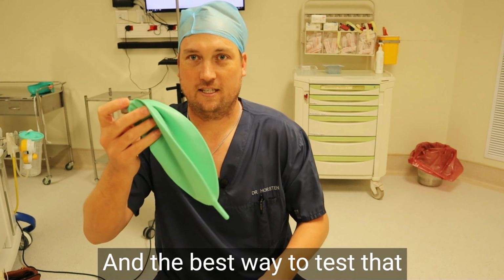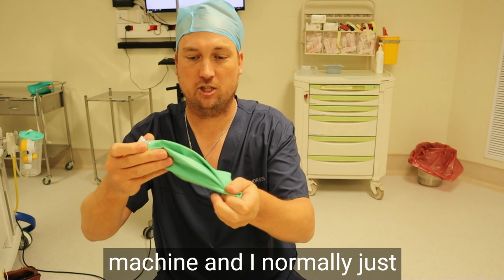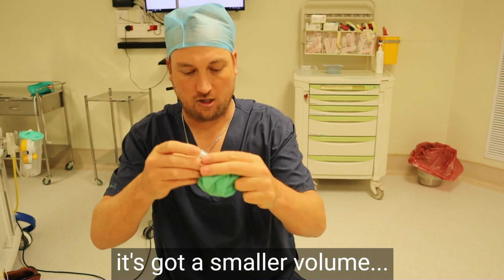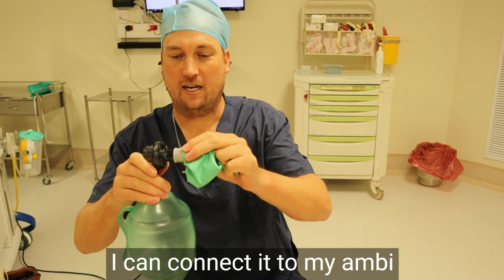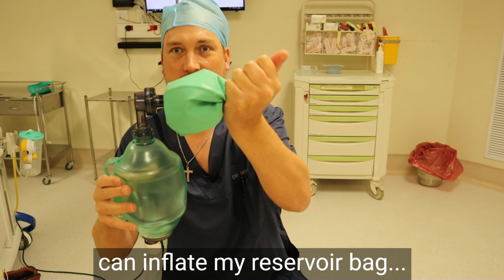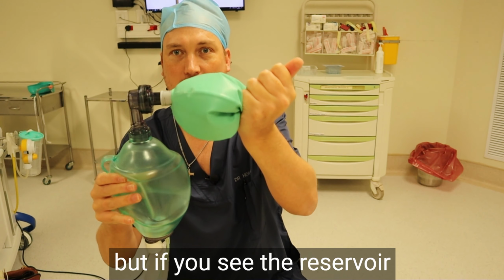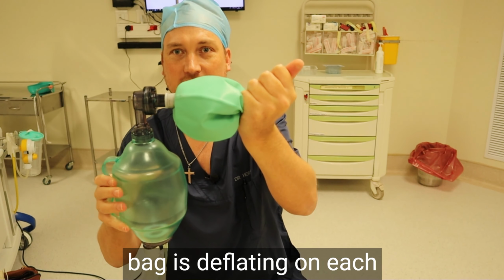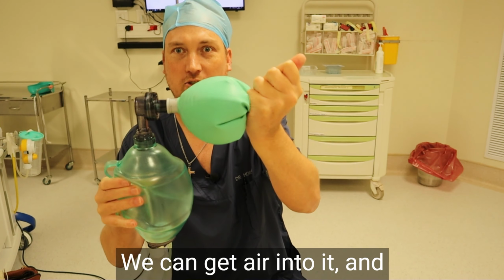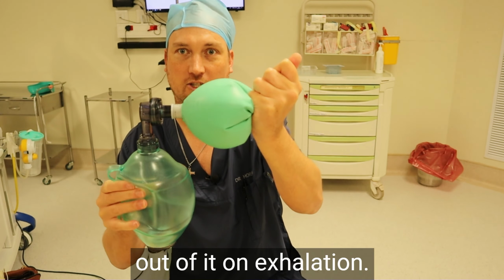The best way to test that is by taking the reservoir bag of your anesthetic machine, and I normally just scrunch it up a little bit so that it's got a smaller volume. I can connect it to my ambu bag, and then I can check that I can inflate my reservoir bag. But if you see, the reservoir bag is deflating on each exhalation as well. We can get air into it, and then air can freely move out of it on exhalation.